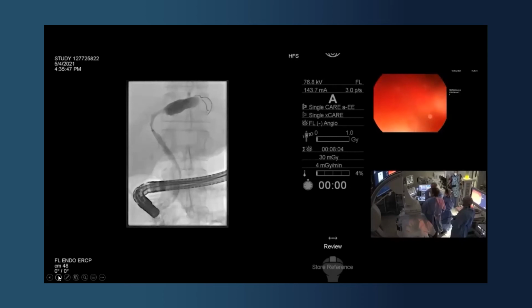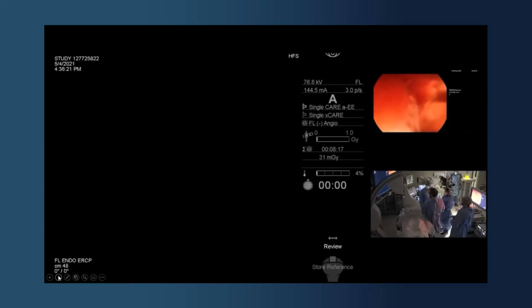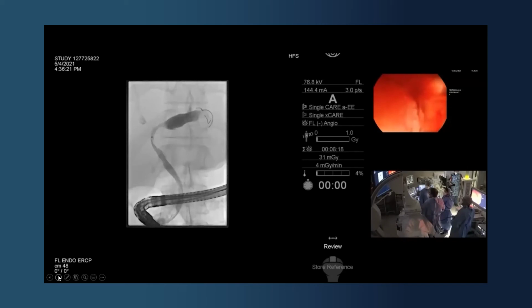Can you blow the balloon up more? Not much is happening there. Oh, there we are. It's quite useful, that, isn't it? Can you come up the patient just to sniff, please? Screen. Lovely. Nice. Keep injecting. Can we get it in here? Screen. Yeah, good. Okay, good. Excellent.